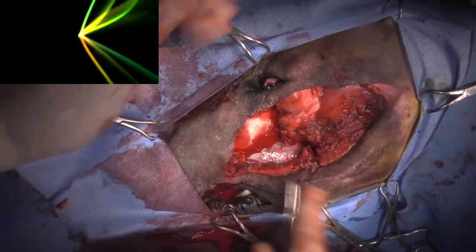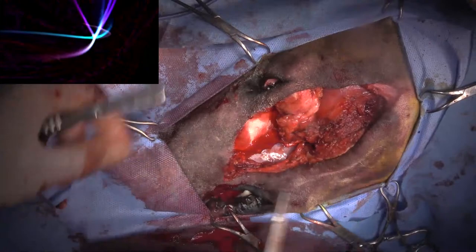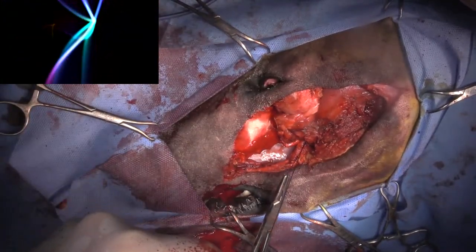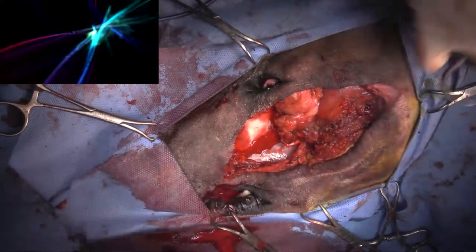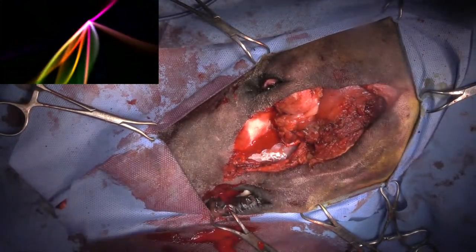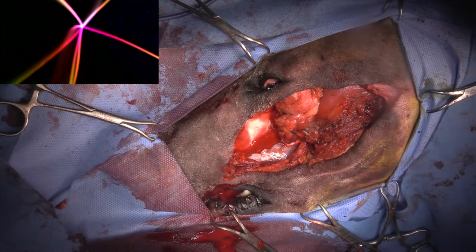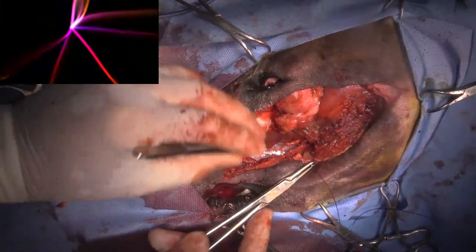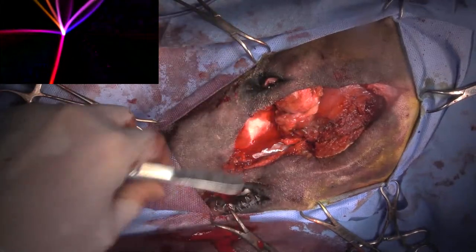How much does the dog weigh? 45, so its blood volume is about 3 liters ish, 2.8 to 3. We've lost 4 is about 14%. 4 out of 28 would be 1/7, which is 14%, right? So 14% of the blood volume, which is fine. We're replacing. I mean, we estimate that he's got a little bit more blood, maybe 10 to 14%.